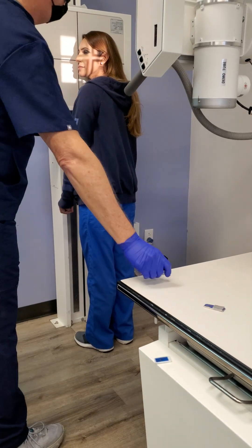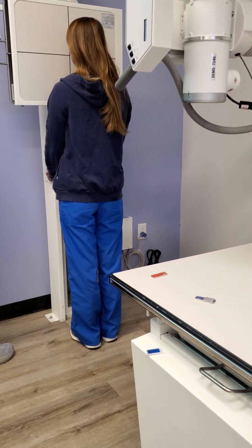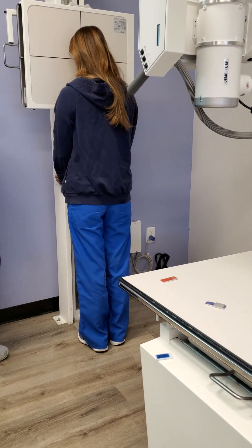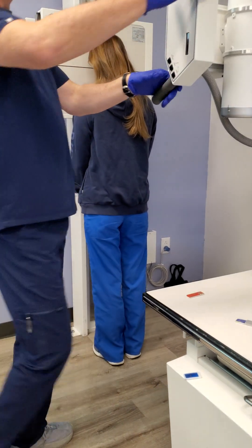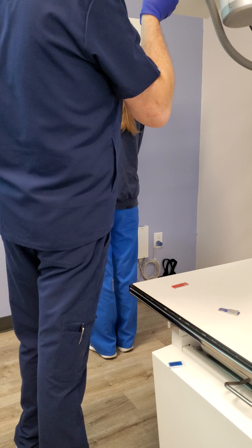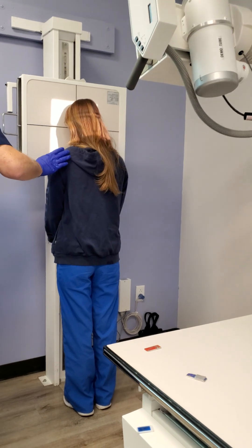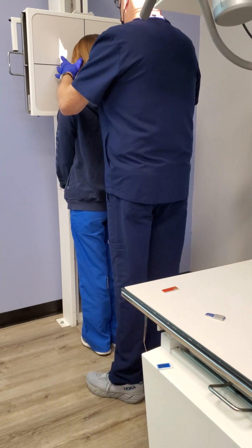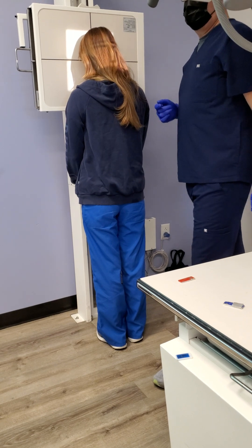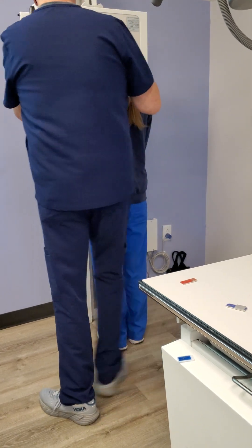We're going to go ahead and go to Caldwell. We're going to have you facing the board. What structures do we start with touching the board? Nose and forehead. So go ahead and face your nose and forehead to the board. Central ray needs to exit where? Nasion. What's our angle? 15 degrees caudad. How do we ensure there's no rotation on this one? Equal distance — the EAM. External acoustic meatus are equal distance from the board.